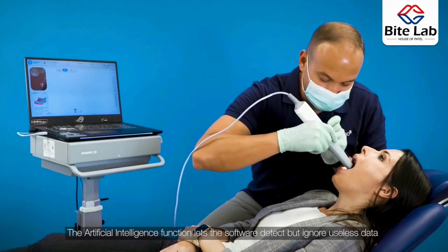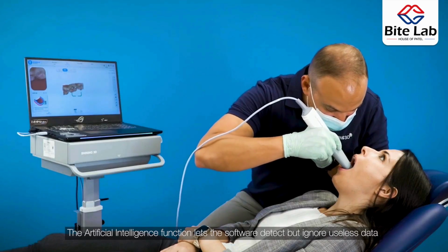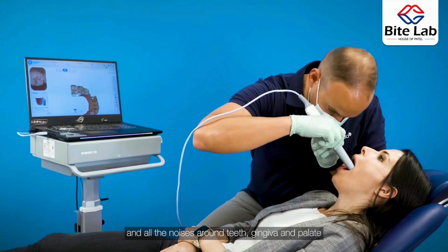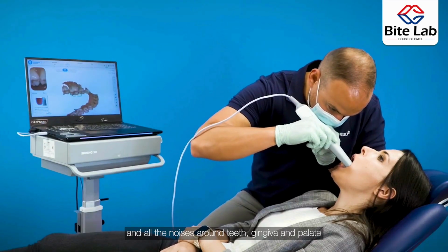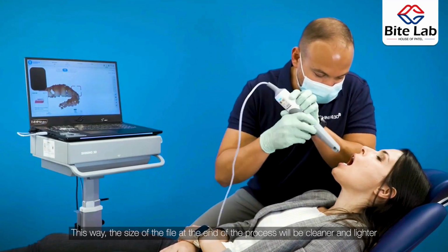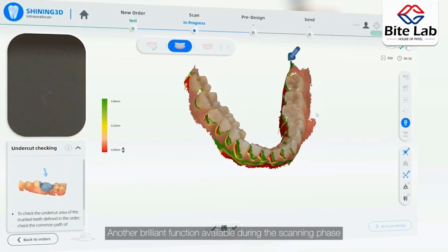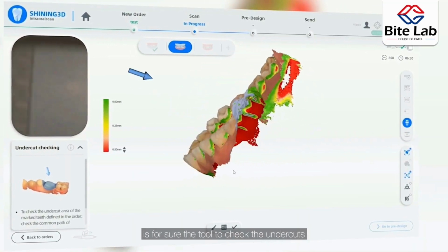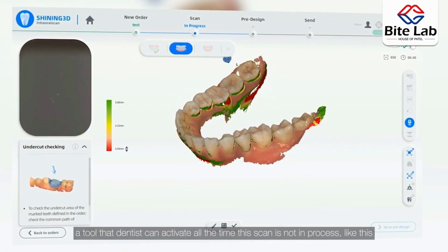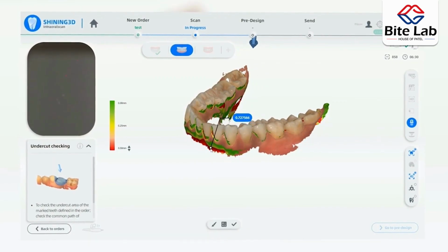The artificial intelligence function lets the software detect but ignore useless data such as tongue, cheeks, dentist fingers, and all the noise around the teeth, gingiva, and palate. This way, the size of the file at the end of the process will be cleaner and lighter. Another brilliant function available during the scanning phase is for sure the tool to check the undercuts, a tool that dentists can activate all the time the scan is not in process, like this.